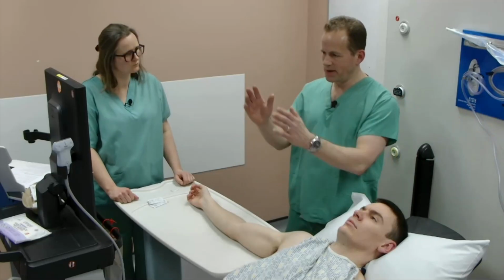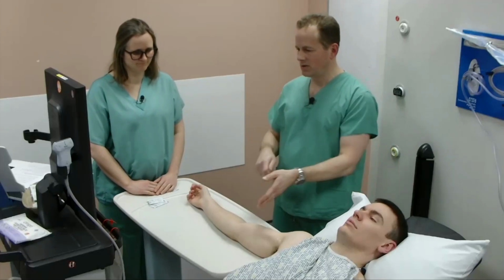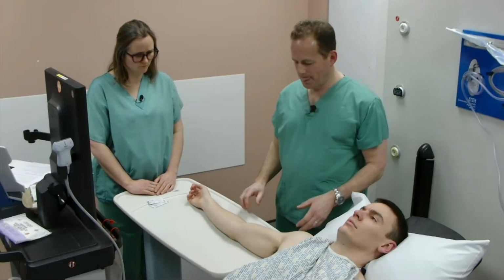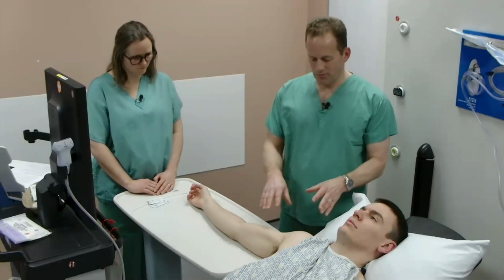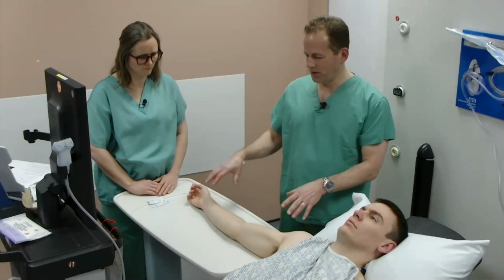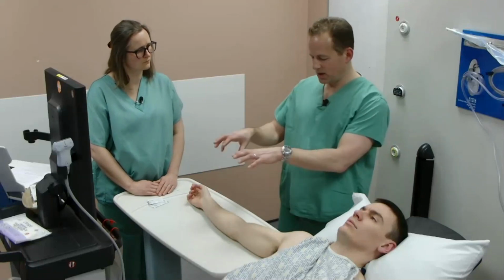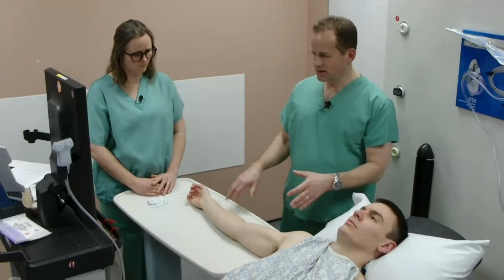You want to be ergonomic. So here we've got our ultrasound machine directly opposite us, so our hand and our needling, we're all in line, at a comfortable height. And this puts the arm in a good position, not only to do our brachial plexus block, but we can also then do our distal blocks following on from that. Because normally in my practice, I would use a proximal block with a short acting agent supplemented by longer acting distal blocks. So yeah, I like to stand like this.